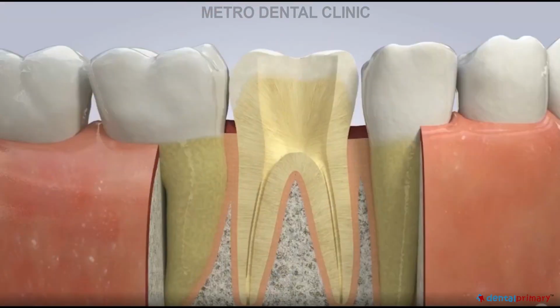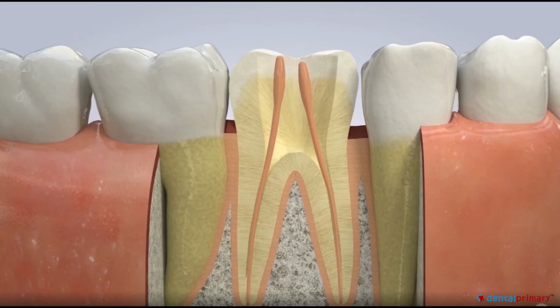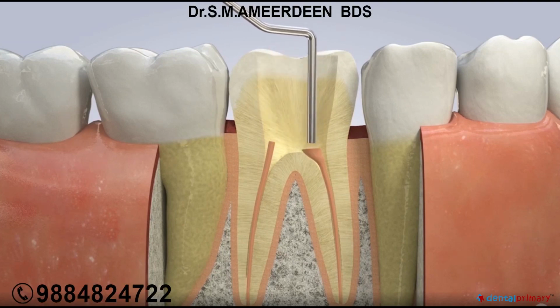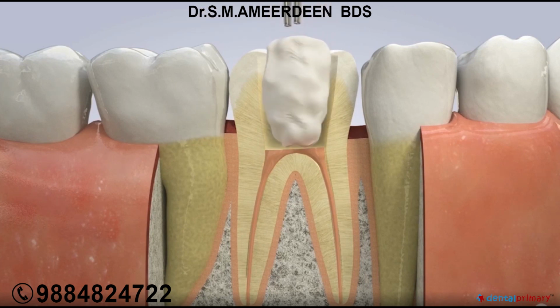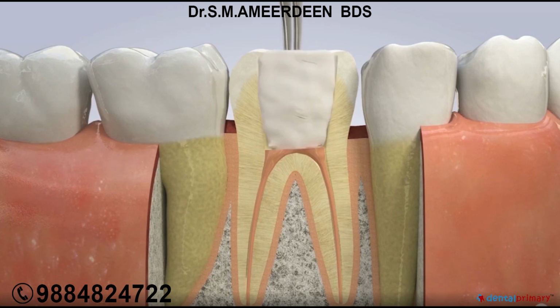Once the pulp chamber and root canals are cleaned, the next step is to fill the tooth. This may be done at the same time as the root canal, or may be postponed until the next visit depending on the dentist's judgment and the amount of infection. When a root canal is filled, it is typically done by placing a material with a sealer in the canals and a temporary filling placed on the tooth.